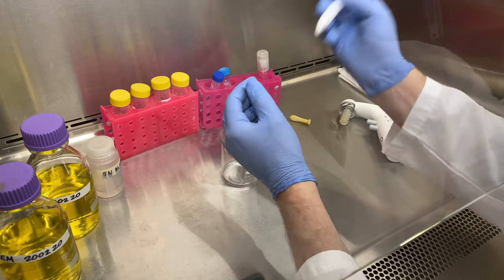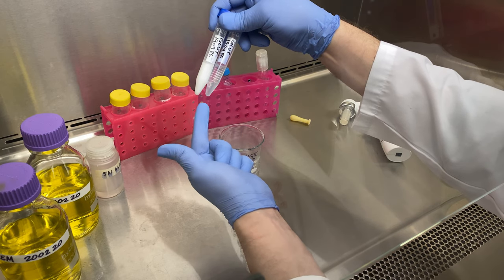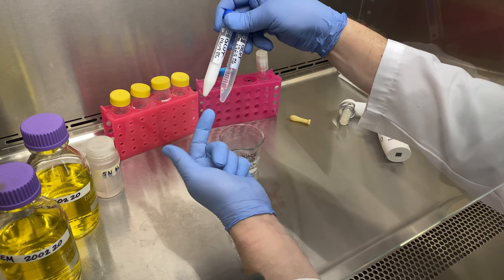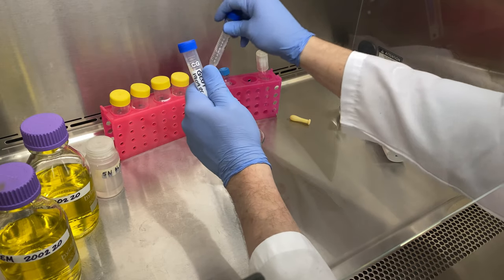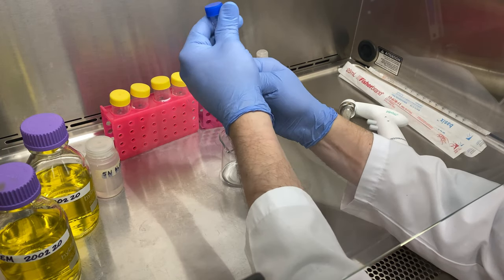Notice I have a tube here — it's glutamine and it's frozen. It's clear when it's thawed out; when it's frozen, it's milky. We'll warm it up and it will go clear. We'll use the heat from my hand to do that.